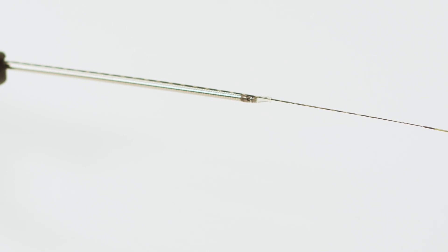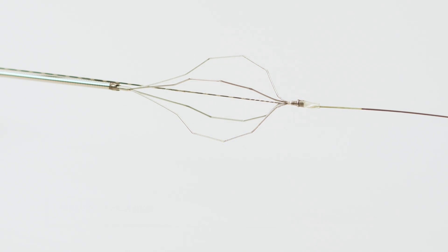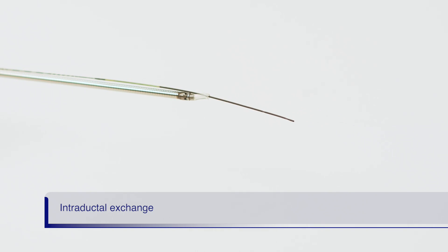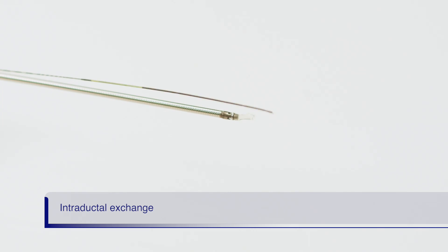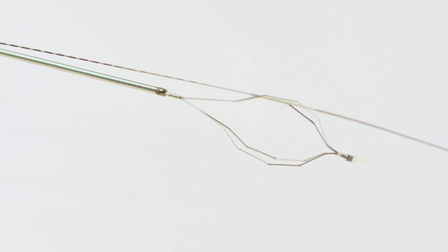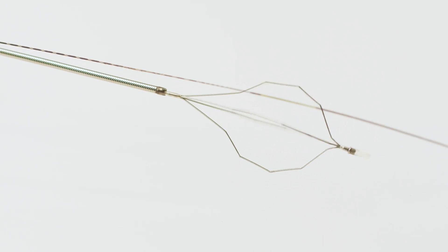Once in the duct, to allow for full basket rotation, separate the guide wire from the basket tip by performing an intraductal exchange. This is accomplished by slowly withdrawing the guide wire while advancing the basket until the guide wire and basket are separated inside the duct. Now the basket can be fully rotated without being caught in the wire, and the wire can maintain ductal access during the entire procedure.